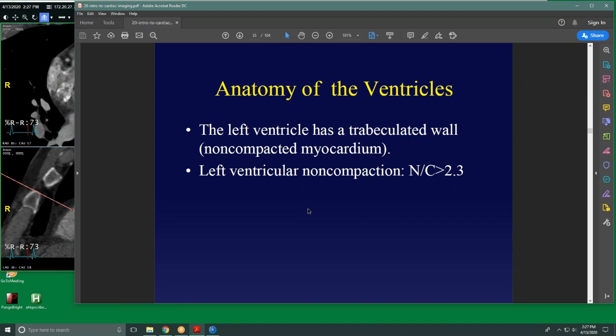Yeah, so a cardiac image that's gated, the patient's hooked up to an EKG, and basically the pictures of the heart are only taken at certain points in the EKG. Well, a study that's not gated, it's not? Well, that's actually kind of a little more complicated. You can either gate your acquisition or gate your reconstruction.